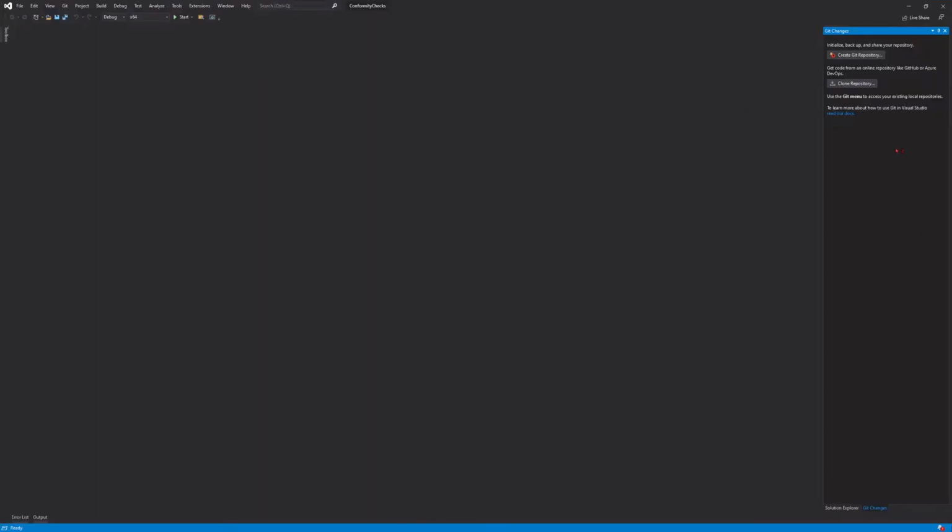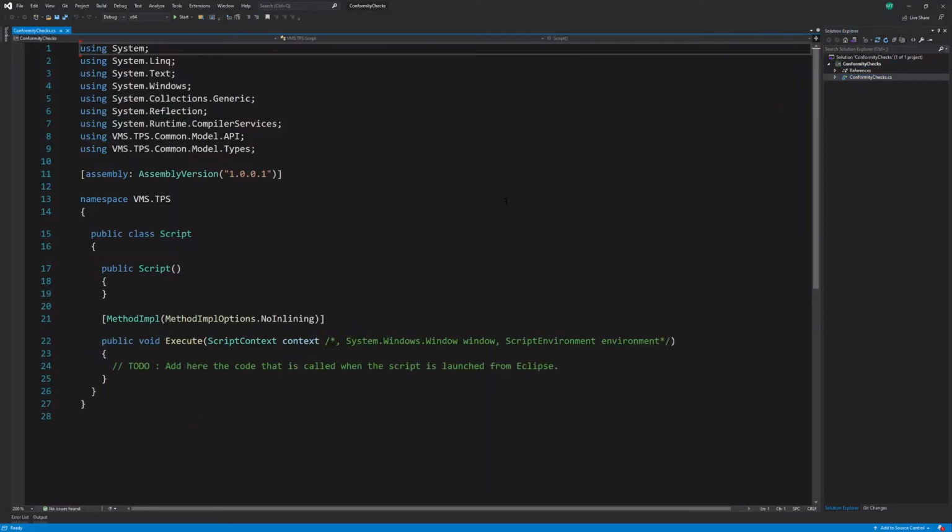Okay, so I might have tried to close that too soon. Okay, now it works. So this is... I hope you should be able to see this. I've got it blown up to 200%, so I may have to make this a little smaller at some point. But if all of this is foreign to you, I have some introductory videos that will cover the basics of ESAPI and using the Eclipse scripting API.